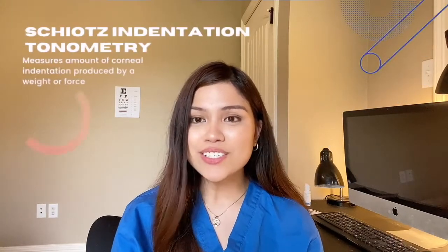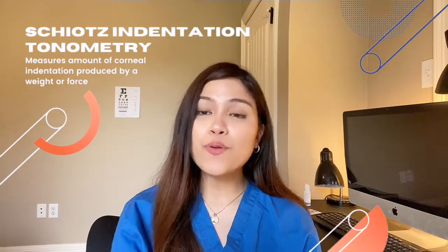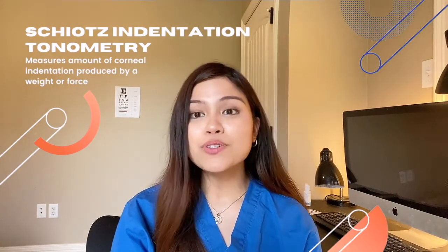The sixth part of the eye exam is the measurement of the intraocular pressure, and there are 3 different ways of measuring it. First, there is the Schiotz indentation tonometry, second is the Goldmann applanation tonometry, and third is the palpation digital tonometry. The first one, the Schiotz indentation tonometry, measures the amount of corneal indentation that is produced by the presence of a weight or a force.